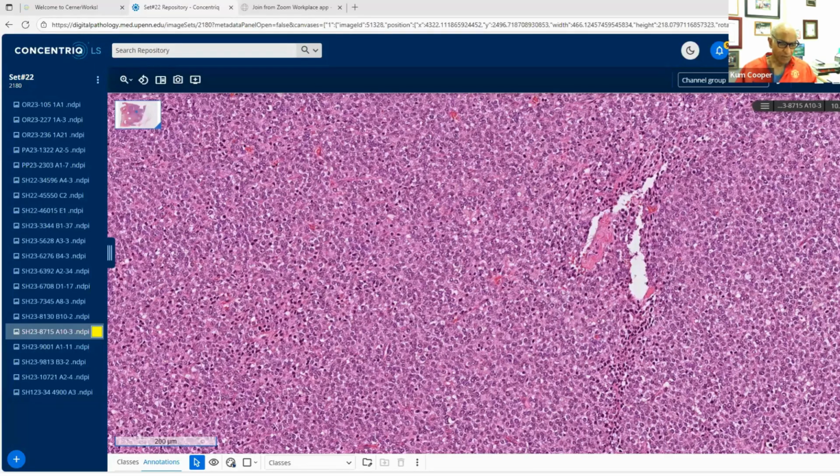So this group of tumors now has emerged and is being widely recognized. And again, it's because of the next-gen sequencing, but they do have a unique immunophenotype. And the immunophenotype that I think about here is more sort of a myoepithelioid. So the myoepithelial markers, think of all the myoepithelial markers, they are variably positive. Not all of them are positive, but they're variably positive.